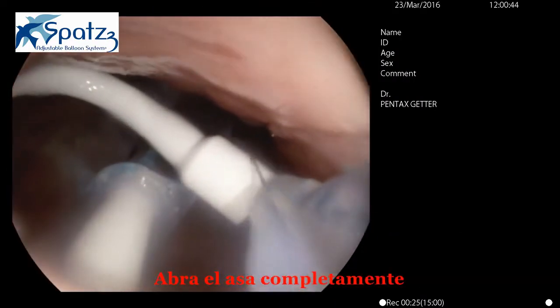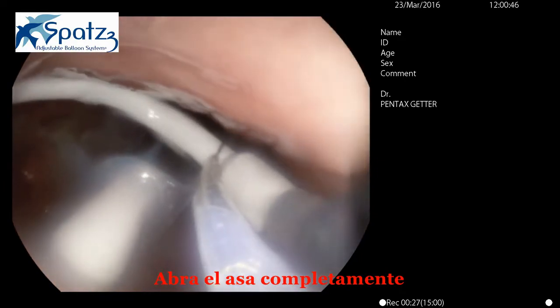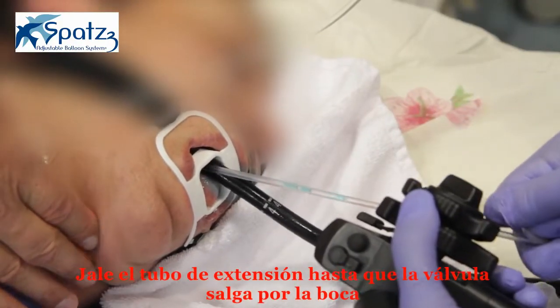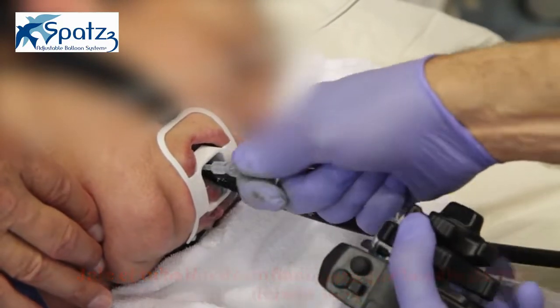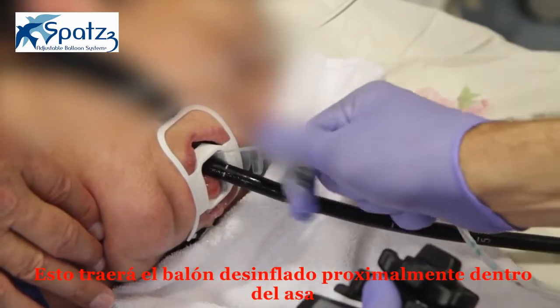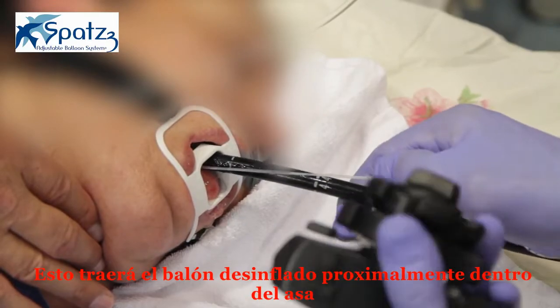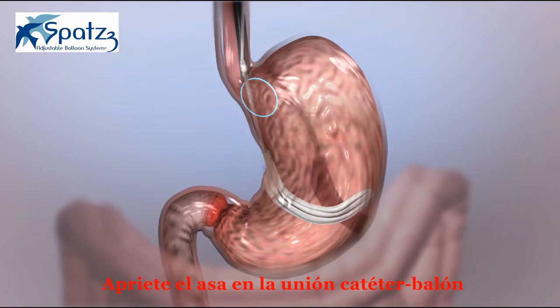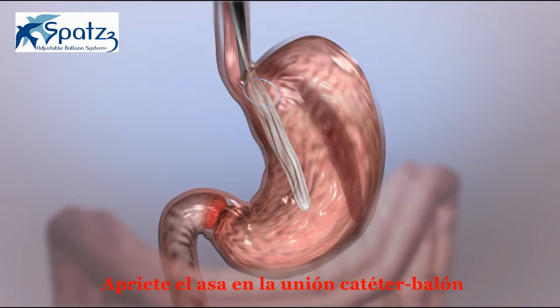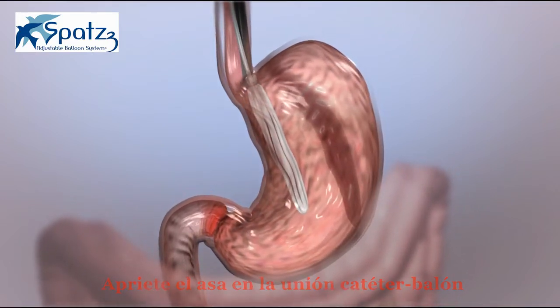Open the snare fully. Pull back the extension tube until the valve exits the mouth. This will bring the deflated balloon proximally into the open snare. Tighten the snare on the catheter-balloon junction, and then pull it back to the scope tip.